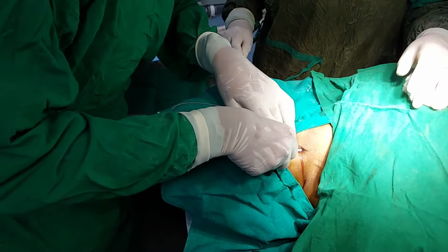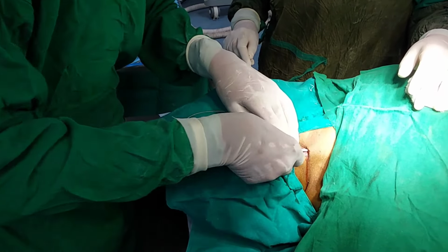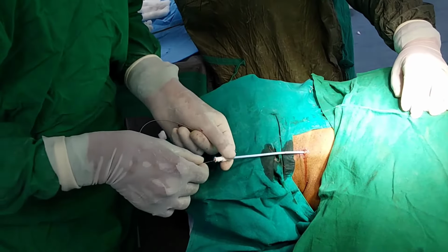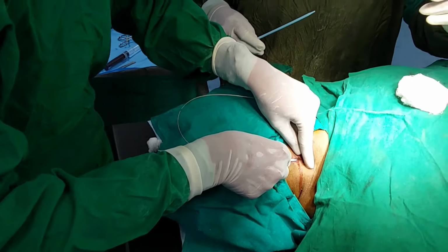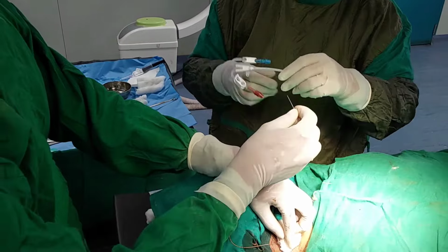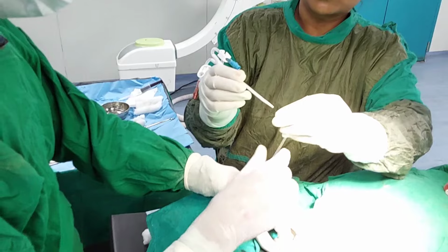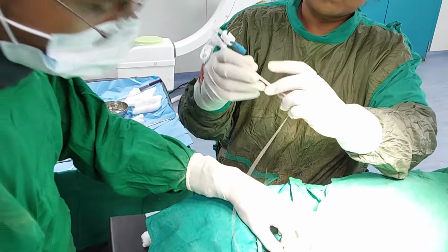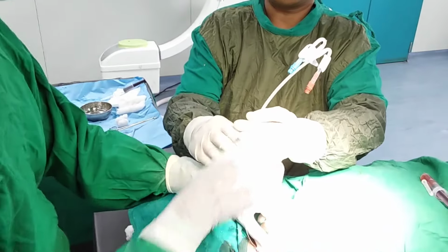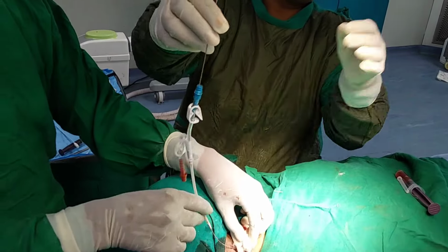You should not insert the whole dilator sheath. You have to just enter the vessel, just inside the vessel. After complete dilation by the small and large size dilator sheath, pass the dialysis catheter through the guide wire. Before that, open one lumen for the passage of the guide wire. See the guide wire coming through the open end of the lumen, that is the blue side.